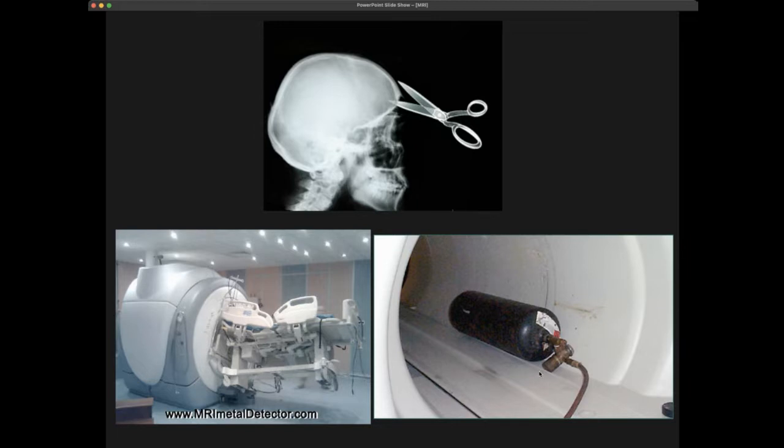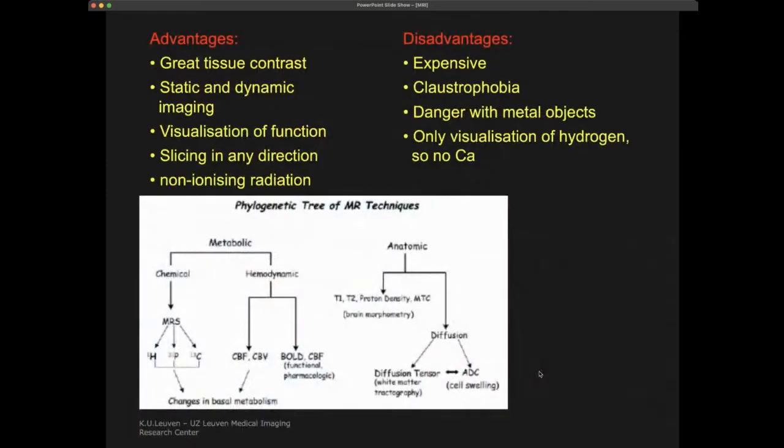And also patients have to fully undress and take all the jewelry off before they can go into the scanner. And the operators and the doctors that go into the scanner, you have to be sure you cannot keep your wallet, for example, in your pocket, because the magnetic information and the chips in your bank cards will be totally wiped. And if you have coins which contain metal, they could be attracted by the scanner. So these are some of the biggest safety problems that you could have with the scanner.